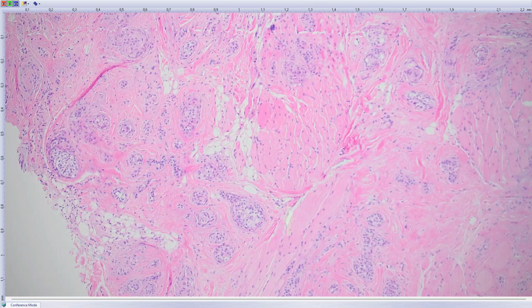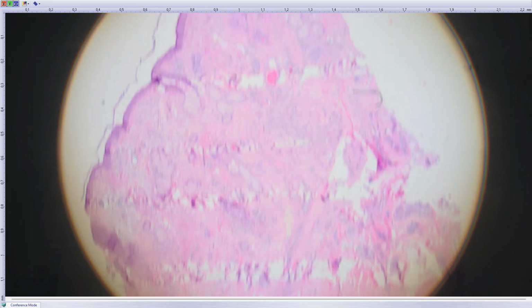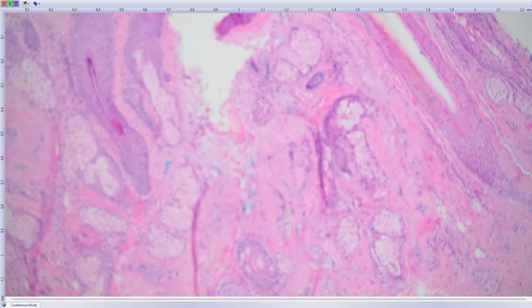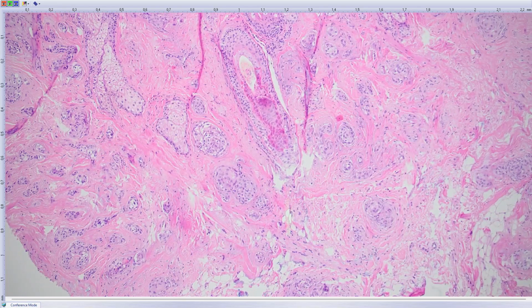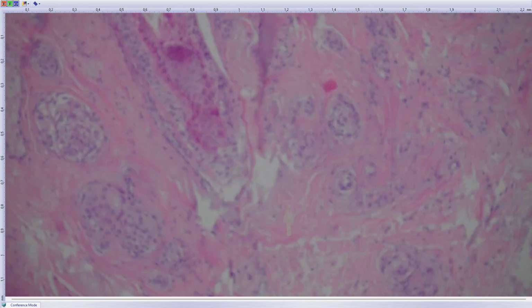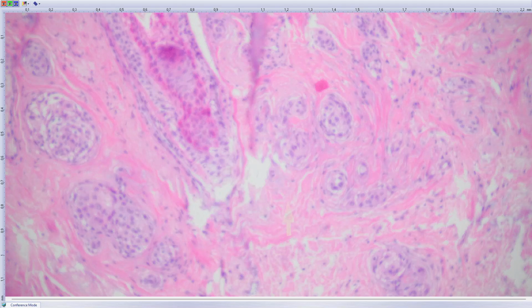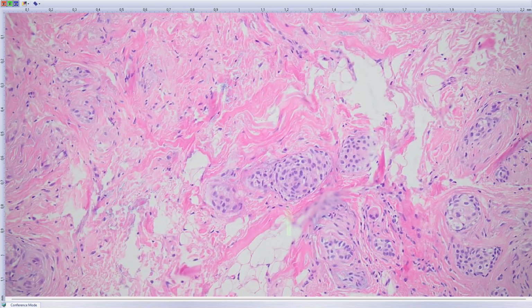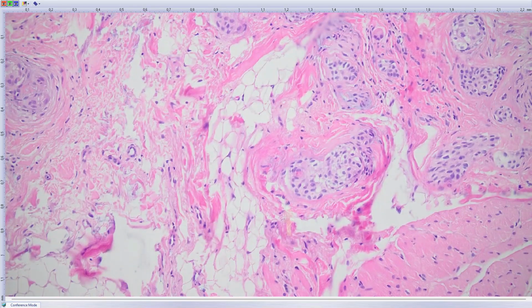Now I have a case of a tumor on the chin of an older patient. What you find are these microfoci which look like concentric balls, which invade the stroma of the dermis and can even show perineural invasion.